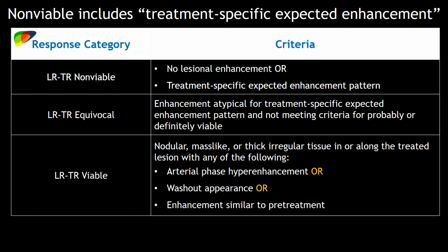This is anecdotal, this is only one case, but in this one case, there was fat on MRI after treatment. The lesion ended up being resected, and notice that in this particular case, this is where the fat was on pathology. The fat was not in cells. There were no live cells, but there was fat material interspersed within a necrotic cavity. I'm making this up, obviously, in this particular case.